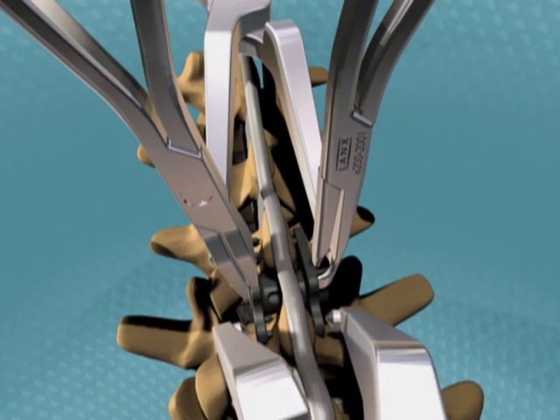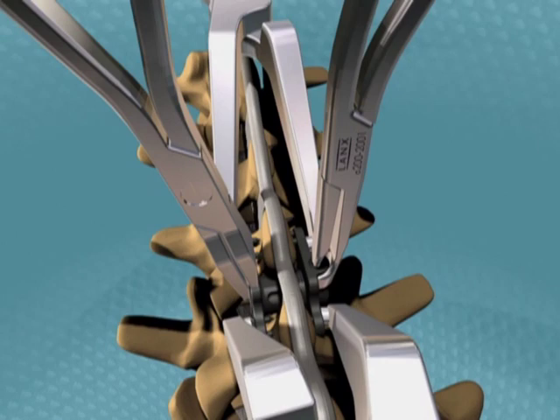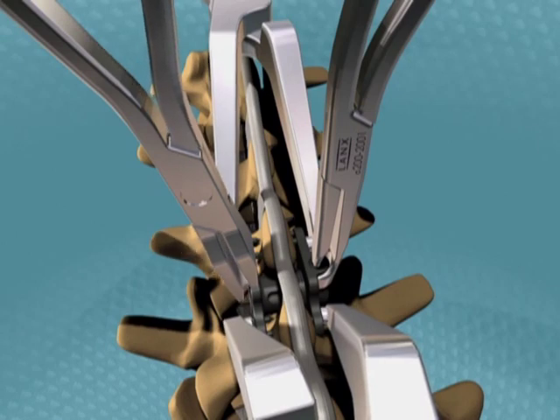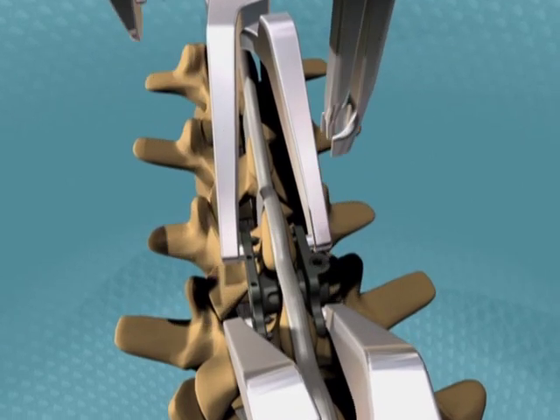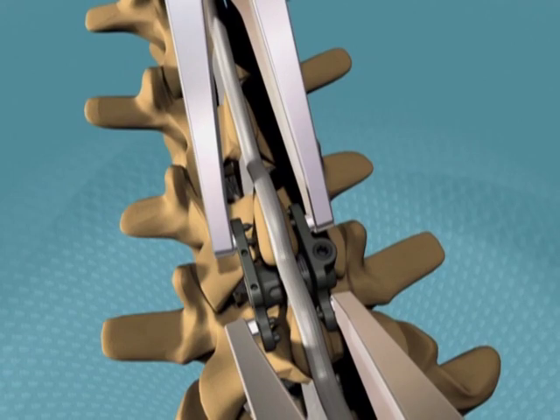Align the conical tips of the compressors into the lateral divots in each plate. Prior to applying compression, it is preferred to remove the lock plate inserter. It is also preferred to take a lateral X-ray prior to compression to confirm proper positioning.